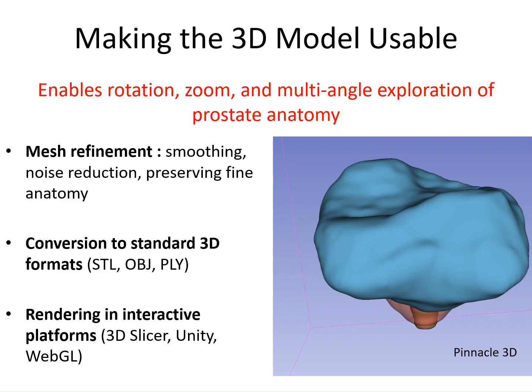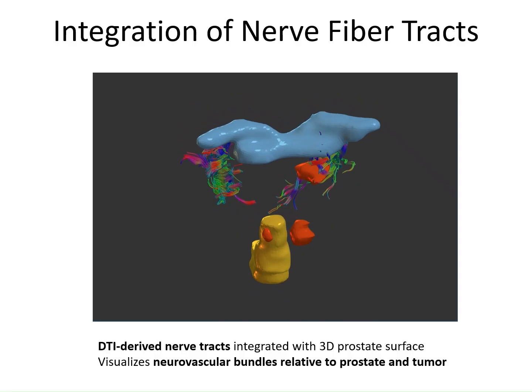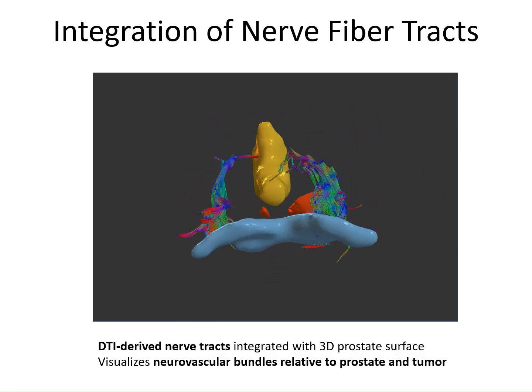This step is a transformation of the 3D reconstruction from a static image into a dynamic, interactive tool for surgical planning.